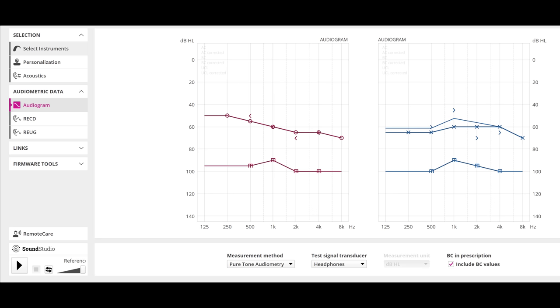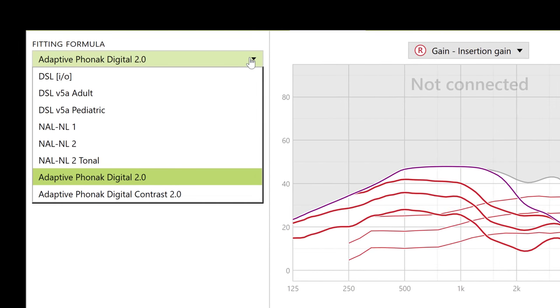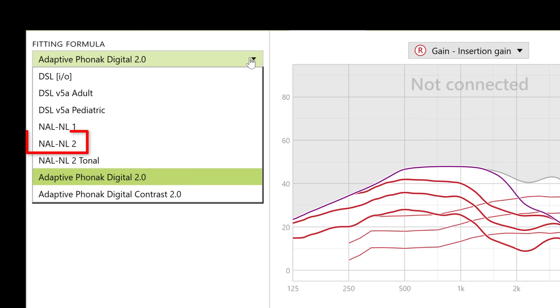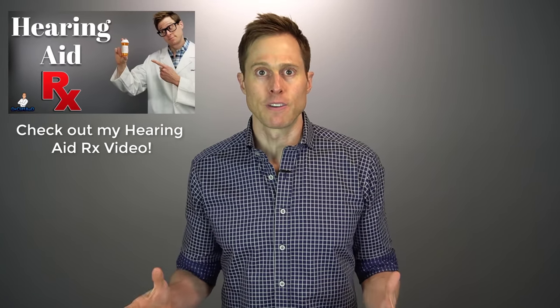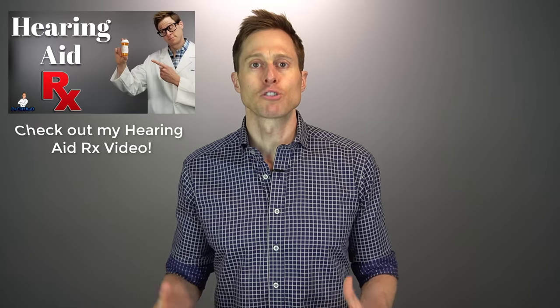Keep in mind that a lot of programming software out there is different, so what I'm covering is very general and not specific to one manufacturer. When you open the programming software and connect your hearing aids — whether wirelessly or wired — you'll need to find a place to enter in your audiogram results. Once entered, you'll have to tell the software which prescription to use. The most common and verifiable prescription right now is the NALNL2, which is a nonlinear prescription most appropriate for most adults.